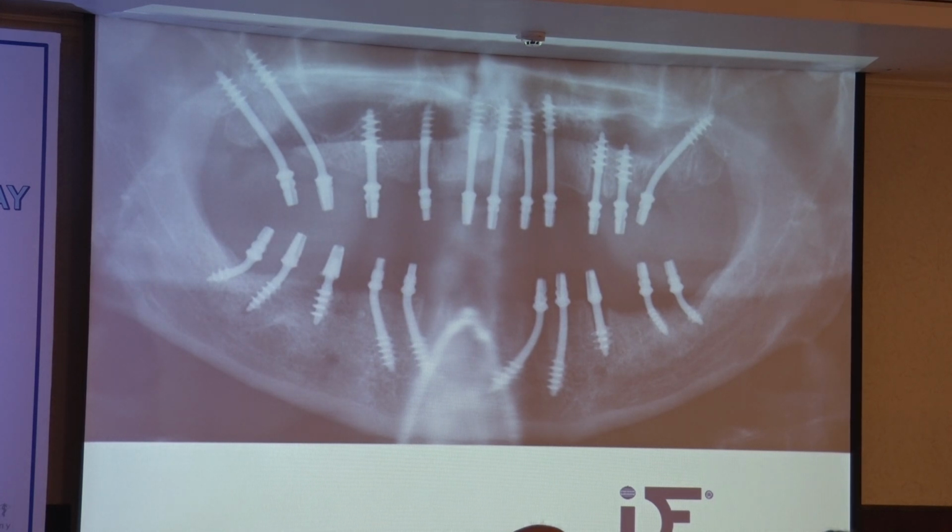Some colleagues prefer to put 10 implants into the lower jaw. I don't think this is necessary as a rule, but it is a possibility. Double tuberpterygoid in the upper jaw on one side, one tuberpterygoid on the other side, combined with more implants. In general, if you have the chance to increase the number of implants from, let's say, 10 to 11 or 12, 13 is always a good idea, because this bone, also the corticals of the upper jaw, are not especially good. When I was learning from Professor Scortecci, he was always saying never under-equip the maxilla. So always put enough implants into the maxilla, and I can recommend this also. I mean, this is a good sentence that you should take home.